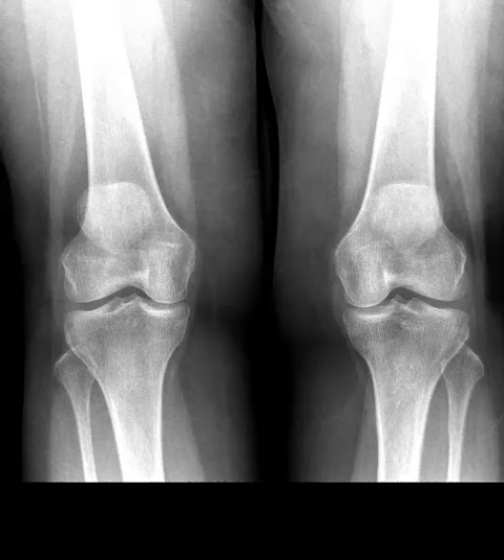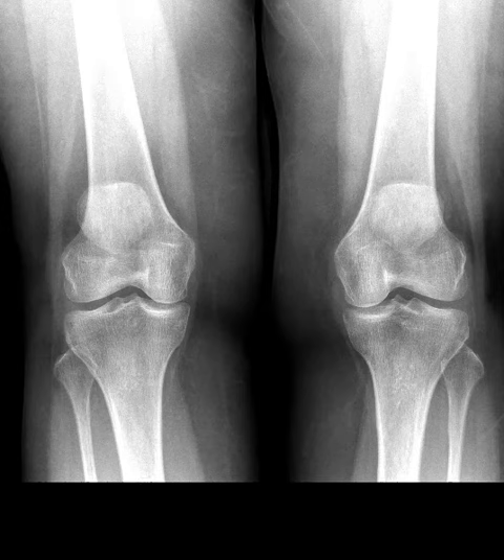Hello, this is Dr. Gay from First Lake MRI. This is a 79-year-old female who complains of knee pain. She's had no prior injury and the pain is worse on the right side. She went to her orthopedic surgeon and they did x-rays that are normal. This is her left knee, her right knee — she has no arthritis at all, which is amazing for 79 years old.